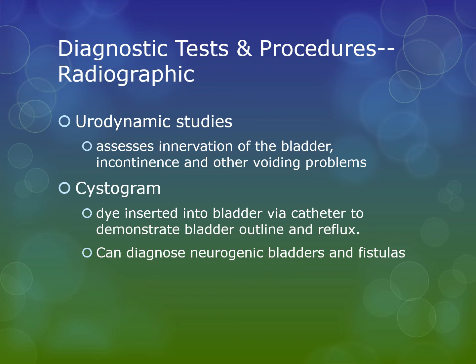That's not normal. The ureters should peristalse in a way that urine should only come down. But if the dye is allowed to ascend, then that's telling us that the ureteral orifices are not doing a very good job of closing that off in between when it's squirting the urine into the bladder.